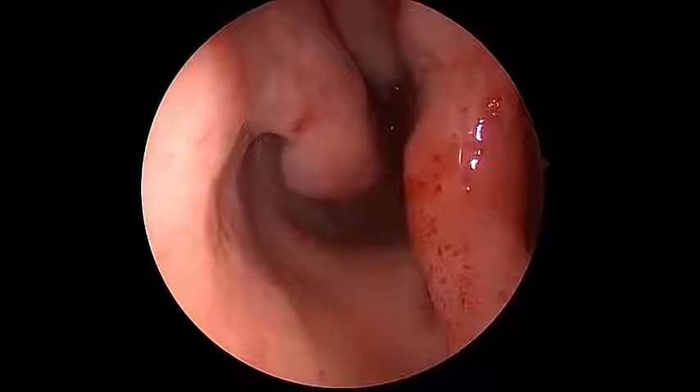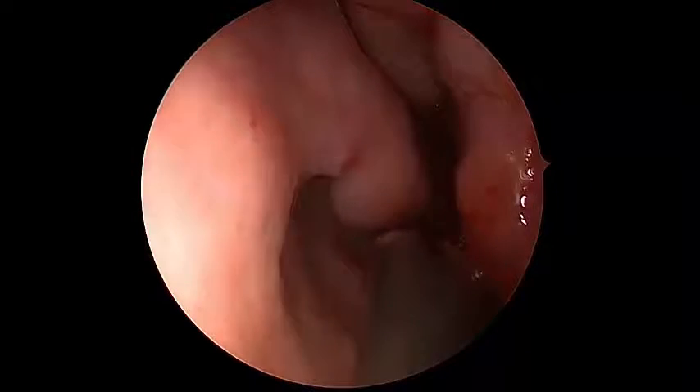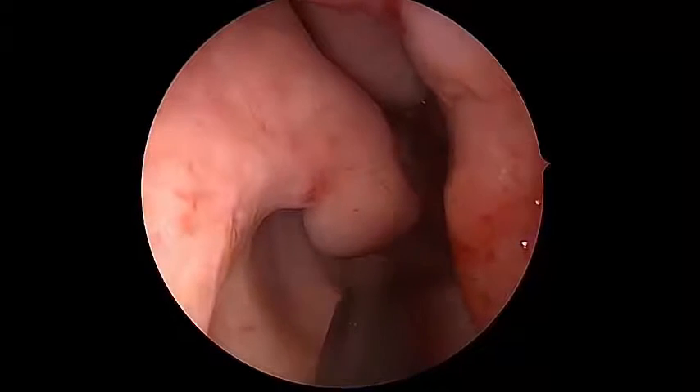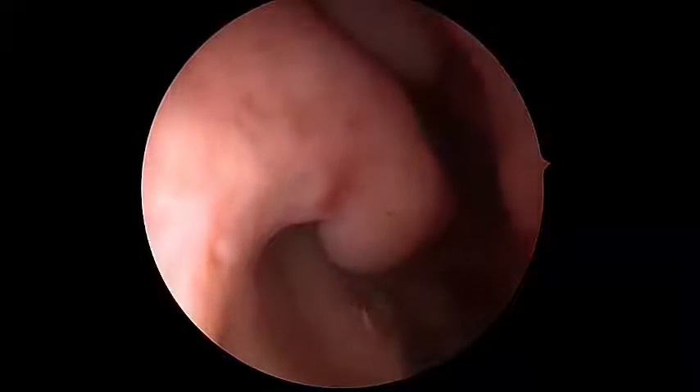This patient has many, many small AV malformations and of course some telangiectasias as well. This is one on the floor of the nose that I'm pointing to here. It looks raised — you can see that it's not just the tip that's raised. It's a small sort of mountain, and you're just seeing the tip of the mountain where it looks like you can see the vessels.